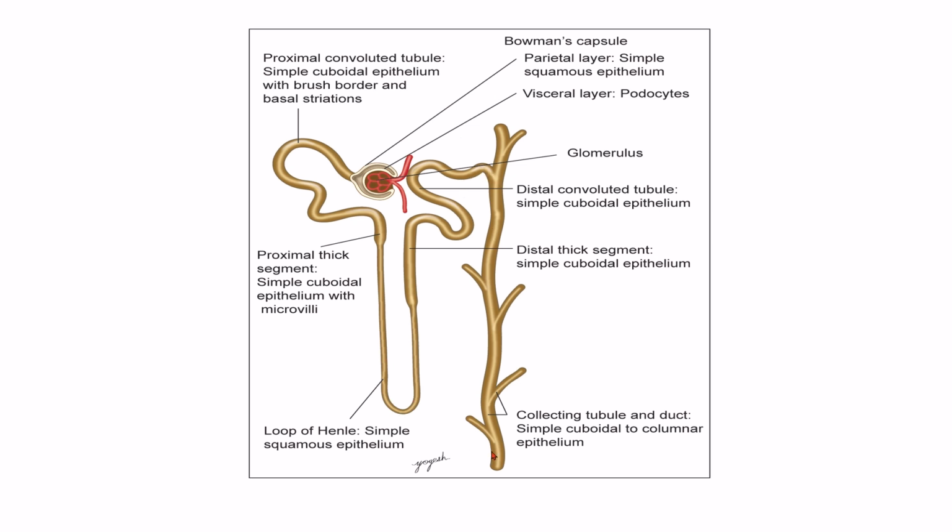This will be the collecting duct. These are the collecting tubules. This will be the distal convoluted tubule, which continues with the collecting tubule.